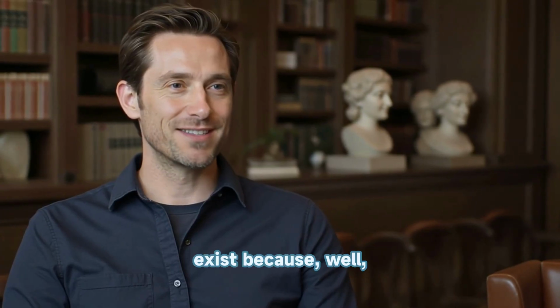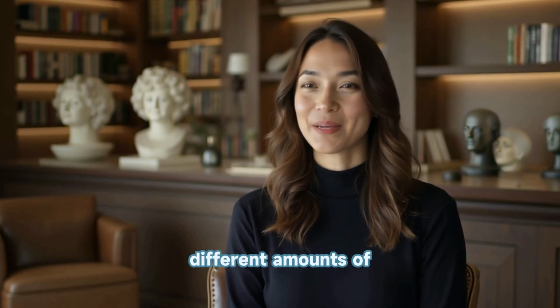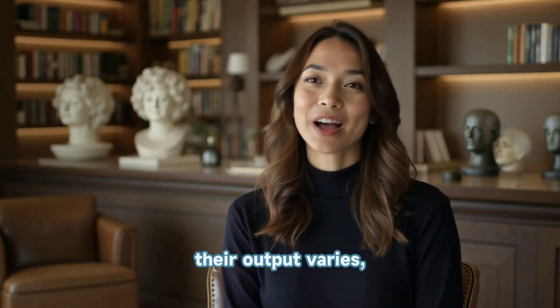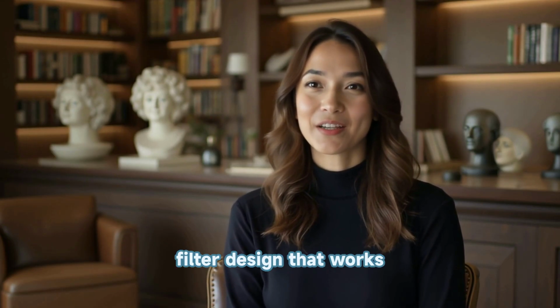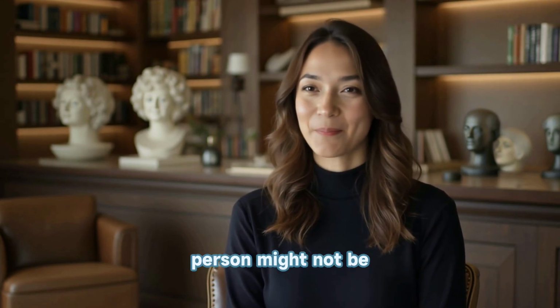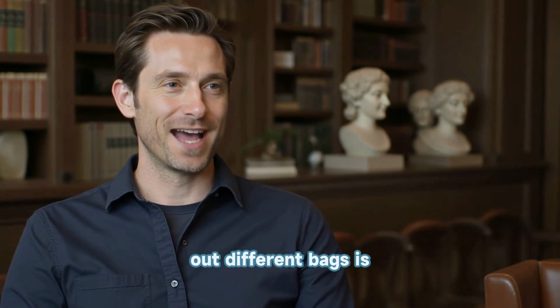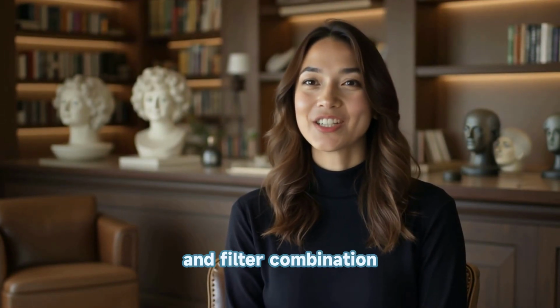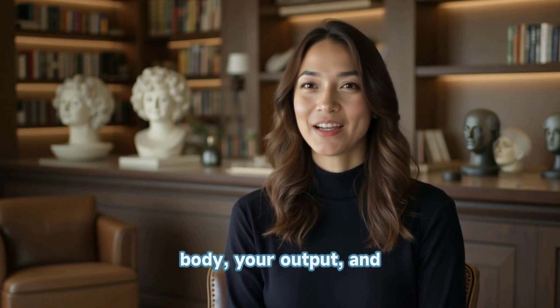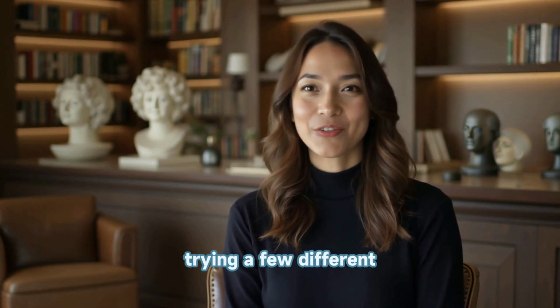And these different designs exist because, well, everyone's different. Exactly that. People produce different amounts of gas, the consistency of their output varies, their activity levels are different. So a filter design that works brilliantly for one person might not be quite as effective for someone else. Which explains why trying out different bags is so common. Absolutely. Finding the right bag and filter combination that suits your specific body, your output, and your lifestyle is key. That often involves trying a few different options.